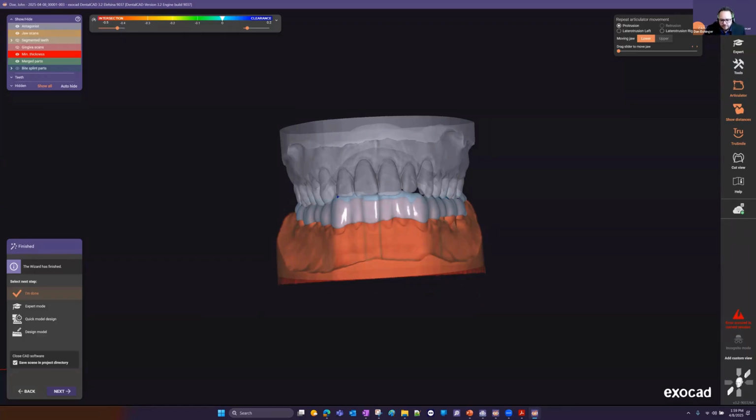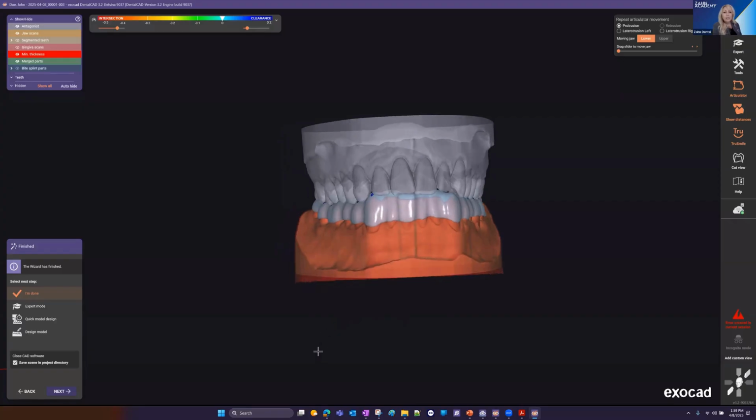Okay, good. So the first question comes from Joseph, and he said that he manages a lab for Clear Choice in Honolulu. And they're in the beginning stages of adding digital design capabilities there. For practice purposes, do you have demo dongles available?